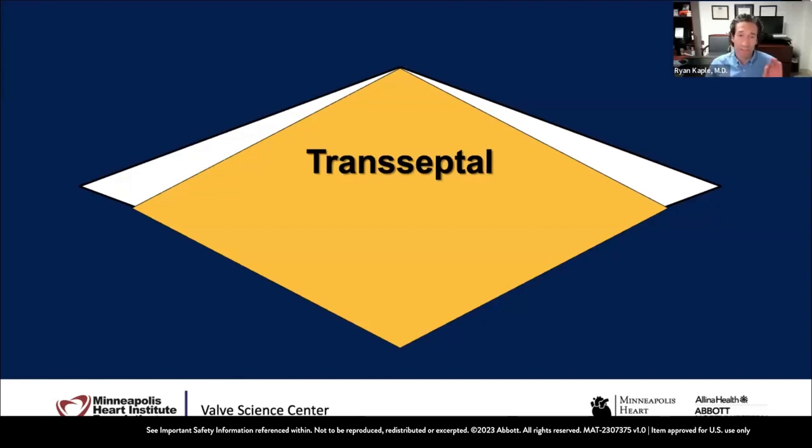Absolutely. And you mentioned the piece about the sedation, which can be challenging to get that perfect level. And the thing that all changes with that level of sedation is the blood pressure. We know that can be really challenging. If you don't have as much MR at the time of the TEE, is it because the blood pressure needed to be lower due to sedation? So I really find it helpful when the person doing the imaging on the pre-screening will put the blood pressure on the screen when it's time to do the quantitative assessment, so that when it comes time to make decisions afterwards, you have that at your fingertips. You have the blood pressure, because we know it affects the loading conditions in such a big way.